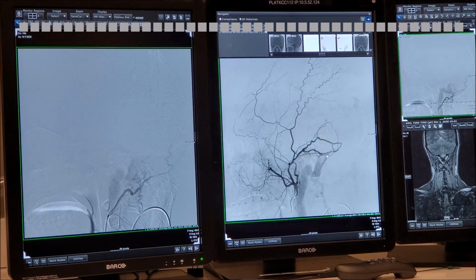Embolize the middle meningeal artery, embolize the occipital. Okay. Yeah, the branches which are not probably, I won't. And how would you embolize? What are the risks? For the middle meningeal, the risks are affecting cranial nerves 7 and 8. I have to pass through the origin of the petrosal. But you're not going to embolize the eye. If you embolize a branch, you're going to come very close, somewhere here or somewhere here, right? So it's relatively safe.